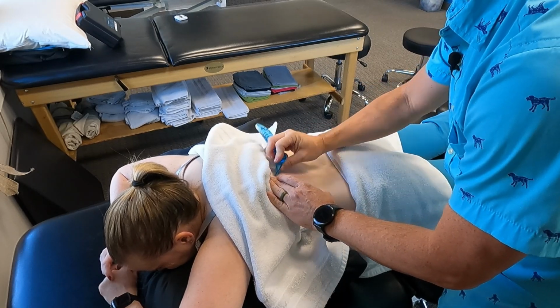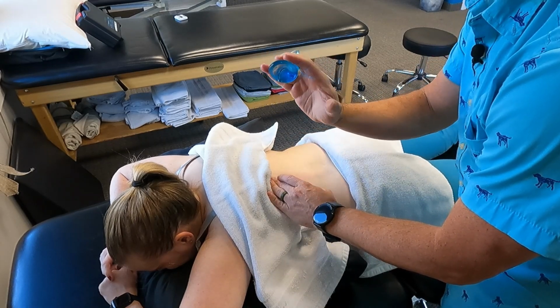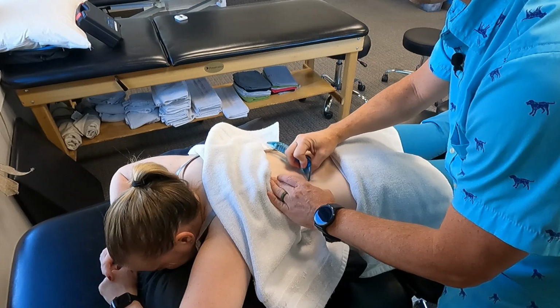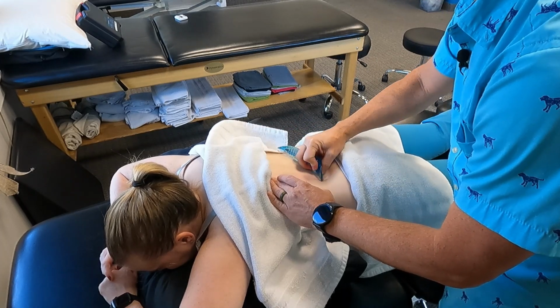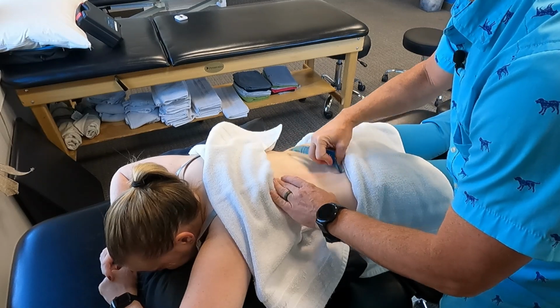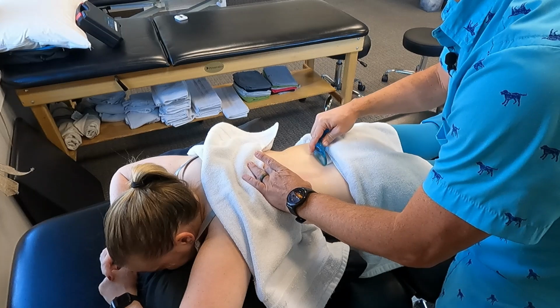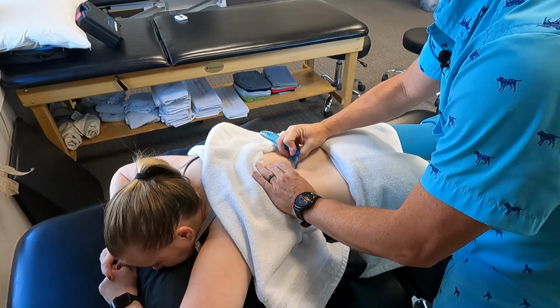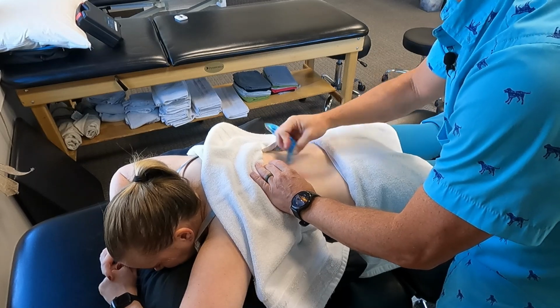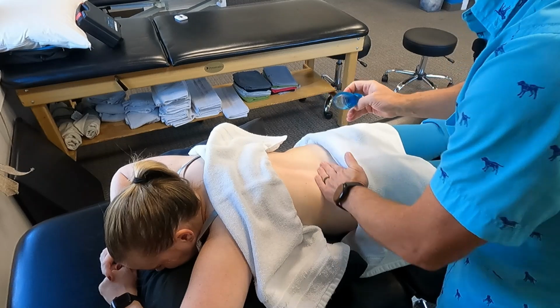So ASTYM tools are the ones that I like the most, just because they have a lot of three-dimensional contours, so I can grab onto them easier, have a lot of ergonomic benefit. So I'm going through the paraspinals first, just to loosen some of the muscles up. Amber, you okay there? Am I pushing too hard? You're good. So always check in with the person that you're doing this on, because sometimes people are more sensitive than others.